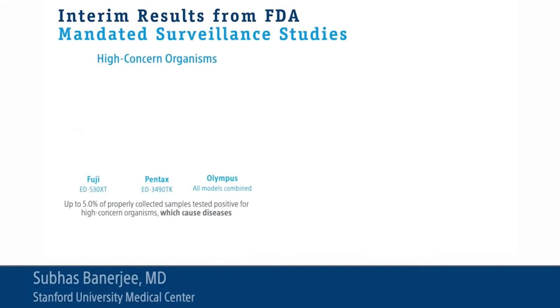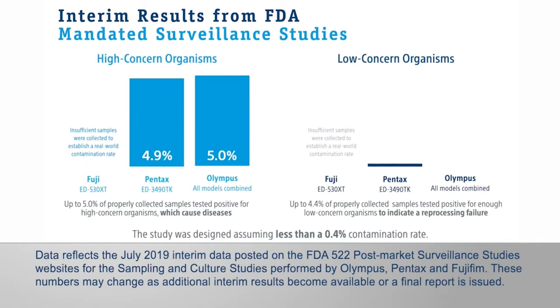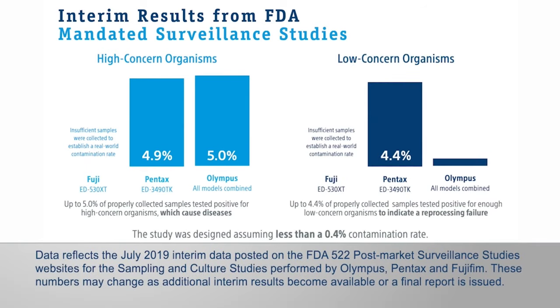The FDA did post-marketing studies indicating a 5% rate of culture-positive scopes despite reprocessing. That's a huge failure rate. One in 20 patients is at risk. That's something that should really wake us all up and have us look at what we can do better and how we can redesign scopes.